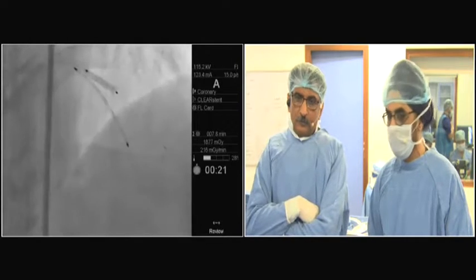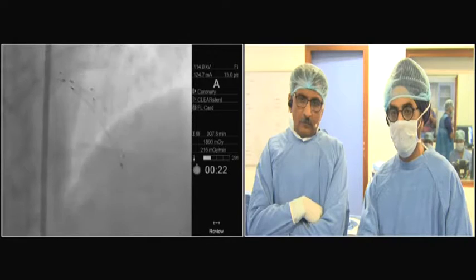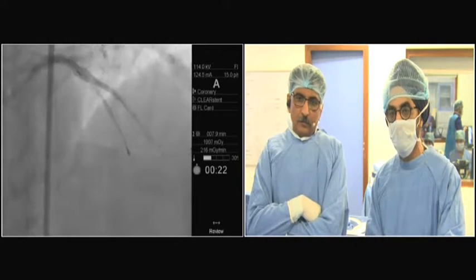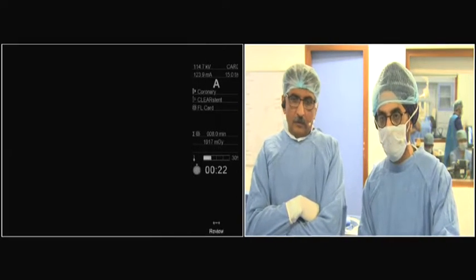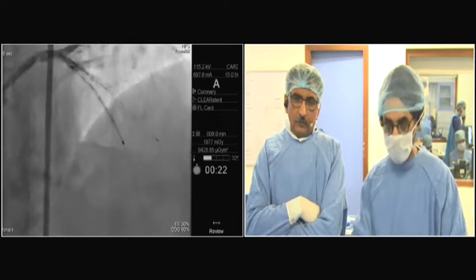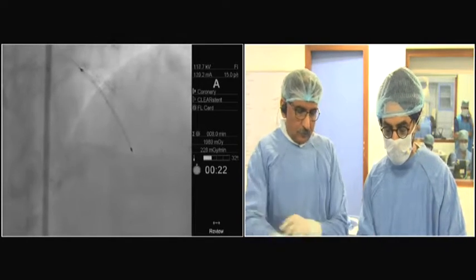For a DK crush, Shaolian will say probably, you put the stent in the side branch and you crush with the balloon in the main vessel. And then you come with the second stent. So this, you are probably in 7 French. To do this, you need a 7 French. But a DK crush, you can do with a 6 French. Right.